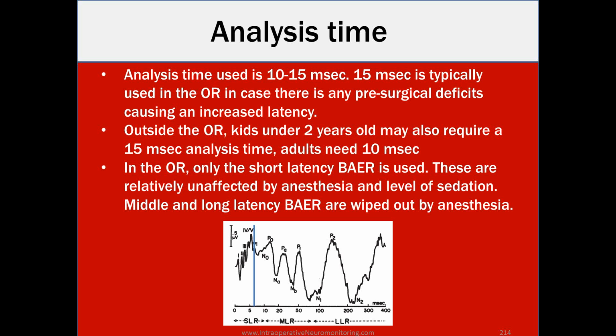There have been some studies looking at these MLRs, the middle range ones, to see if we can adequately assess depth of anesthesia or likelihood of the patient having some sort of awareness or waking up. There has been some credibility to what's been published, but nothing that is substantial enough, or we'd probably be using it ourselves.